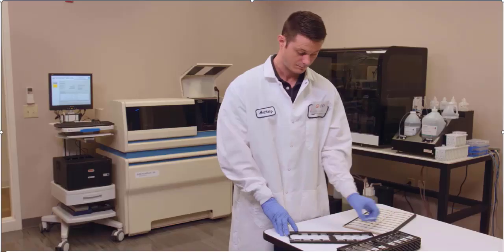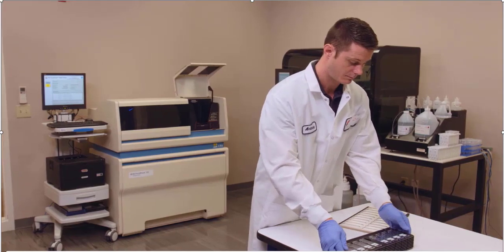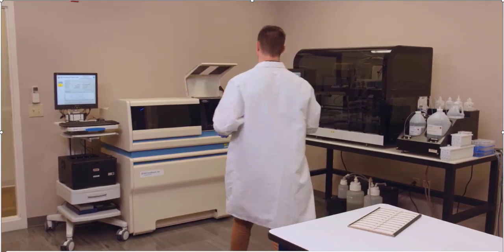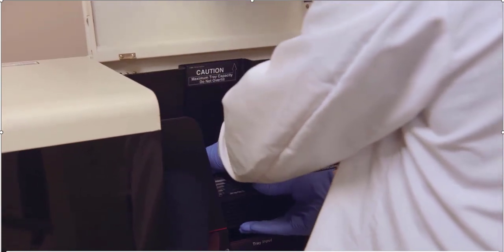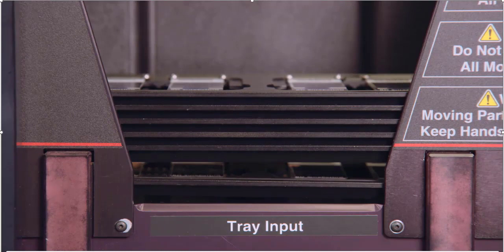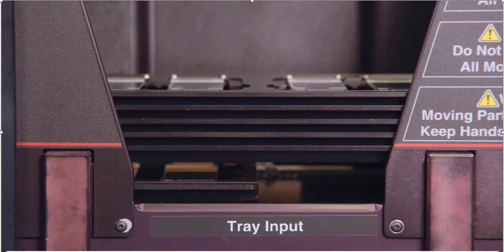To start a run on the BD FocalPoint slide profiler, an operator inserts barcoded slides into trays and loads the trays into the input hopper of the instrument and closes the door. Trays are then lowered from the input hopper and transported to the automated microscope stage.